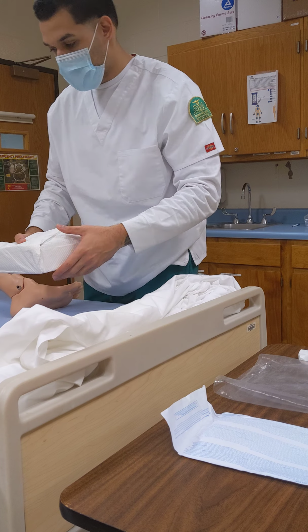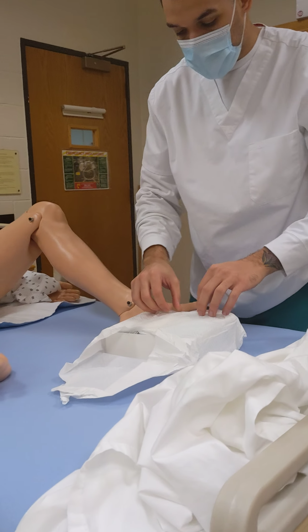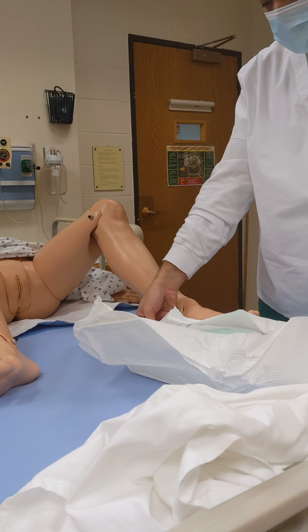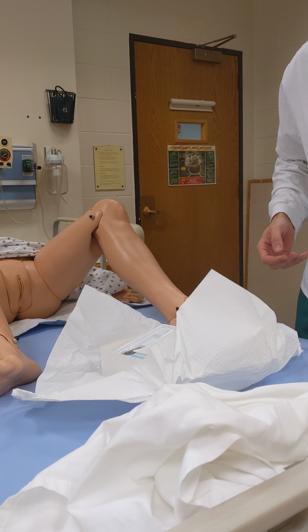Now, because the outside of the kit isn't sterile, it's fine to place it on the bed. I'm going to open it away. Clean down the sides without touching the middle, because that is the most sterile part.